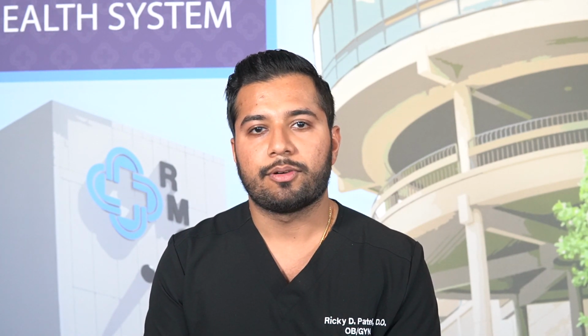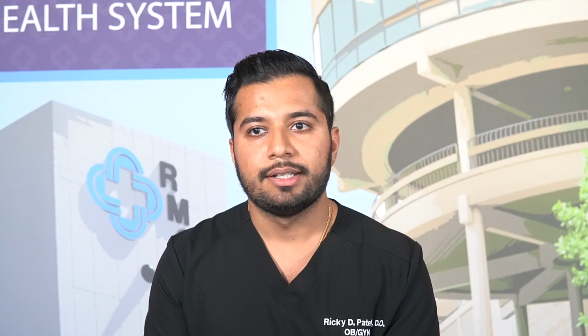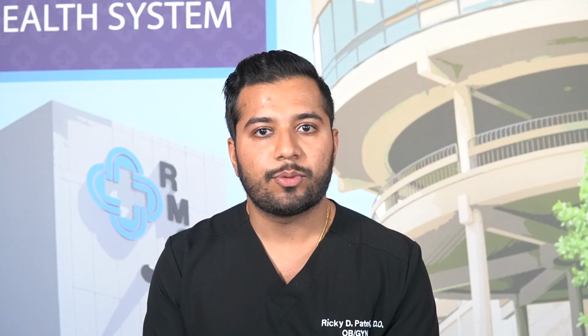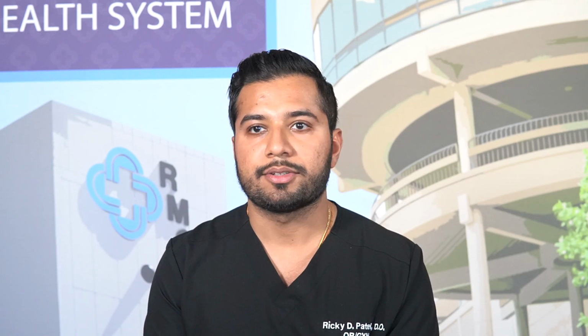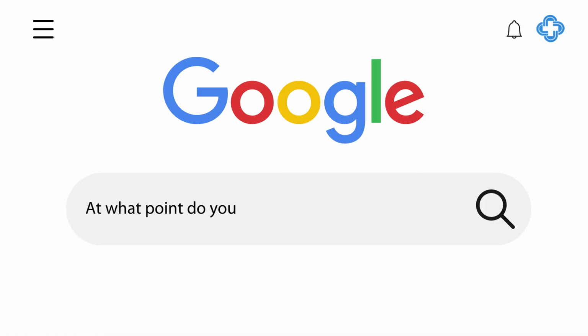One thing, for certain types of surgery, like natural orifice surgery, there are some patients who are not good candidates for it. They might include patients with endometriosis, prior pelvic surgery, or lots of scar tissue. However, robotic surgery, I think most people are pretty much a good candidate for robotic surgery or any traditional laparoscopy.